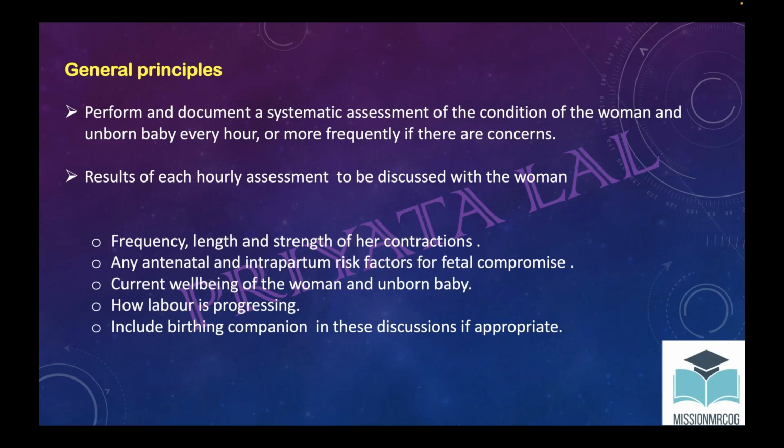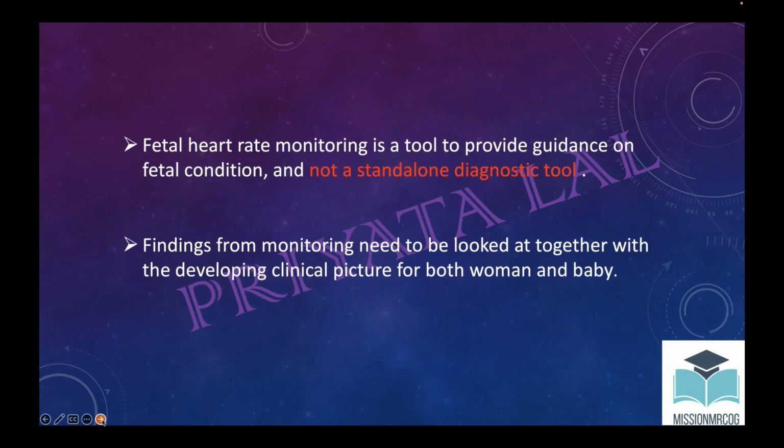Now, on the basis of fetal heart or CTG, we can't make any decision or choice. It is always an overall clinical picture, including antenatal risk factors, intrapartum risk factors, maternal risk factors, fetal risk factors, along with the CTG, okay, and the labor progress. Everything will come when we decide on any management for the patient. So it is shared decision. It is the overall picture that would help. Okay, you cannot decide anything on the basis of CTG alone.